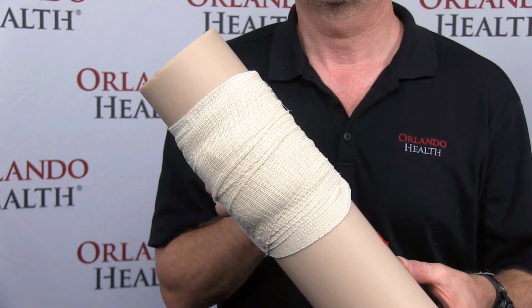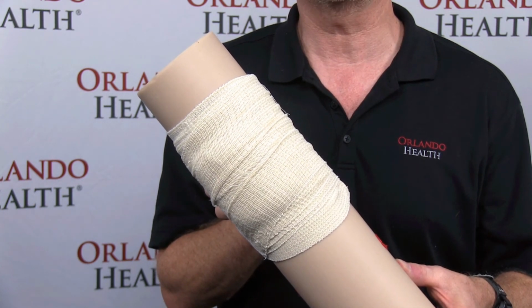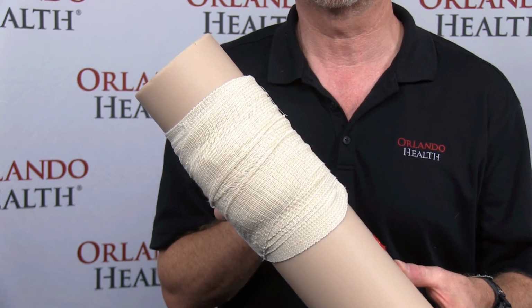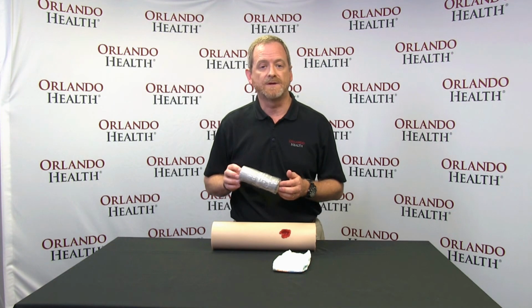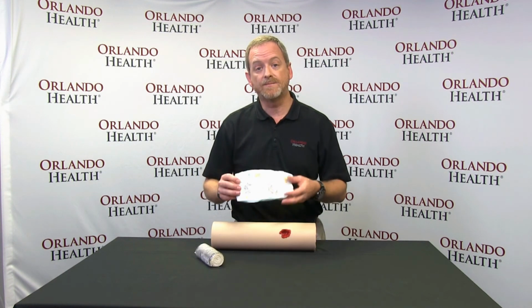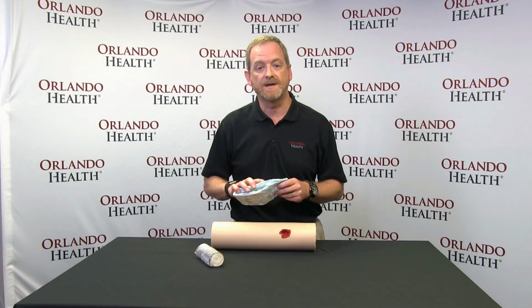Some kits will include a large compression dressing that you can apply over the gauze that you have packed into a patient's wound. Commonly known as an Israeli or battle dressing, these can be purchased online through Amazon or eBay or at your local Army-Navy surplus store for about $5 to $10 each. A compression dressing is not an essential part of your Stop the Bleed kit, unlike a tourniquet or gauze. In a pinch, with some duct tape, you can use something as simple as a diaper to add compression to the gauze and hold your dressing in place.